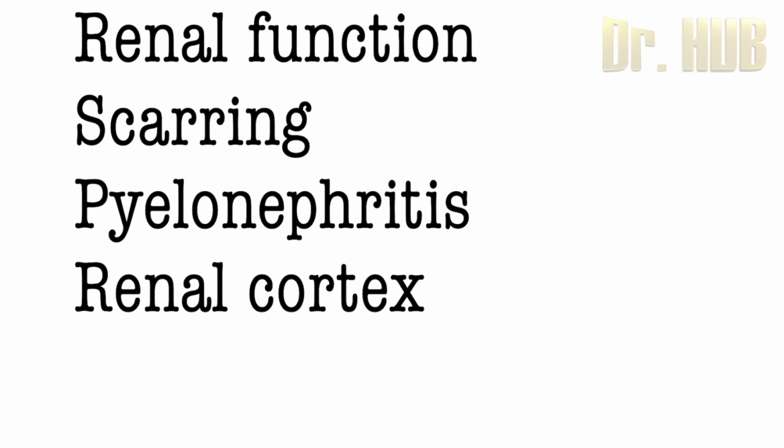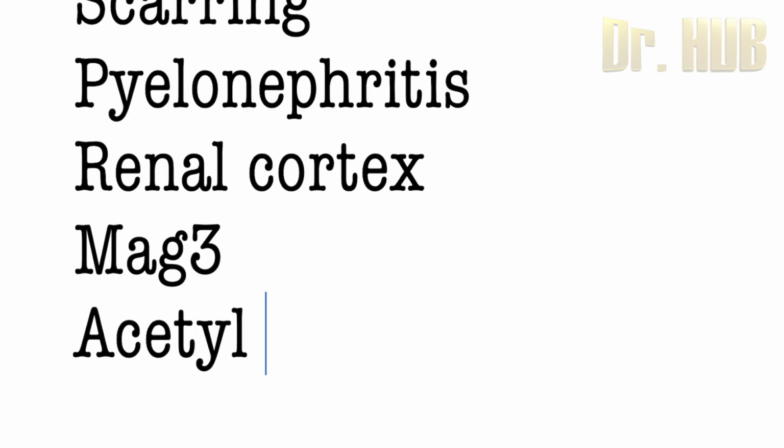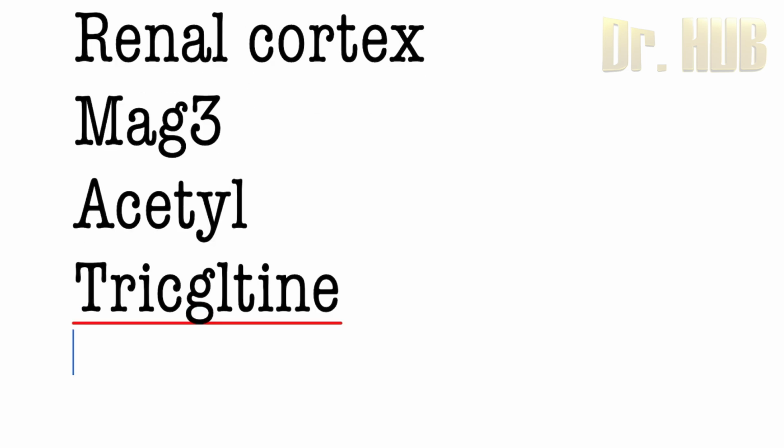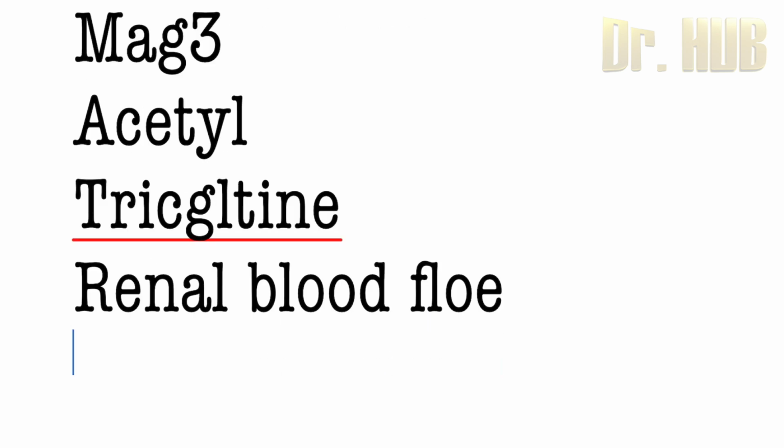Now we move on to the Tc99m MAG3. MAG3 is mercaptoacetyl triglycine. It is used for assessing the renal blood and plasma flow.